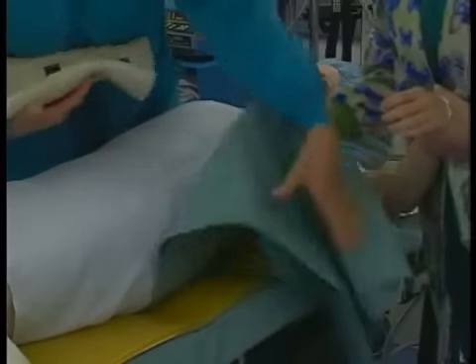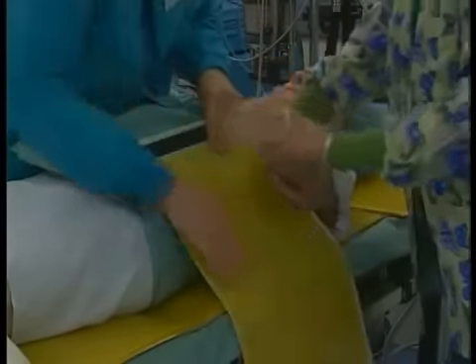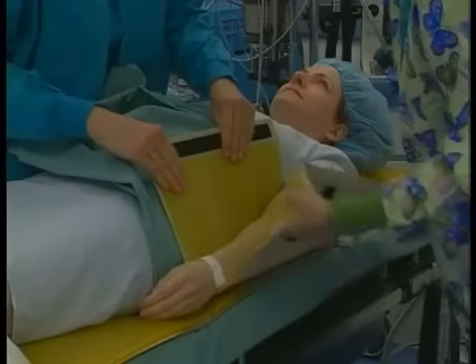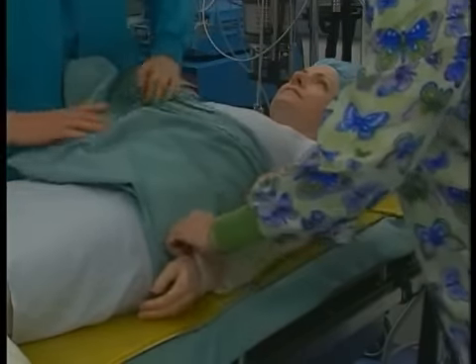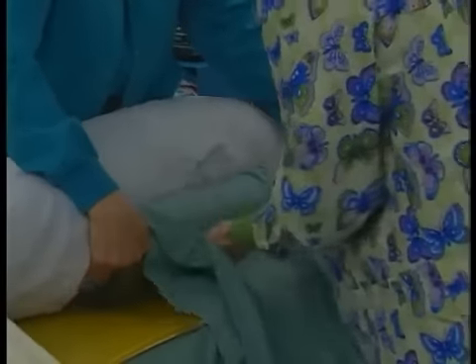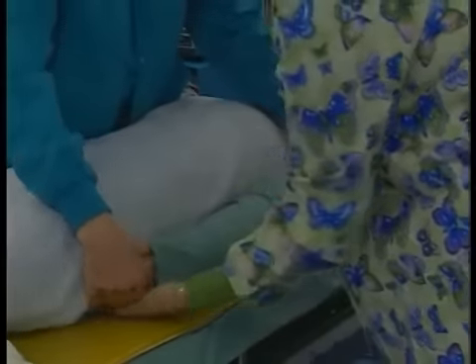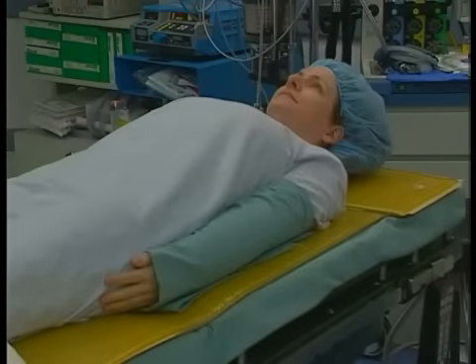If the arms are to be placed at the patient's sides, the palms should rest against the thighs. When a draw sheet is used to secure the patient's arms at the sides, it is important to tuck the sheet between the patient and the mattress, and not between the mattress and the operating table top. This decreases the risk of the arms sagging over the sides of the operating table and causing compression of the ulnar nerve or radial nerve.